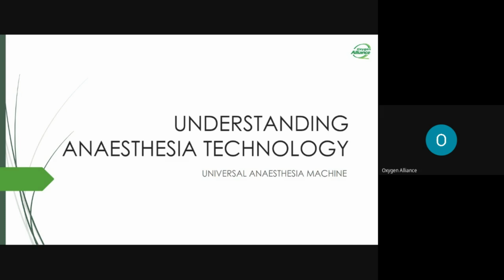So we also have a comment in the chat from Rock Musoli, which says, during calibration, you have to check for leakages in the pipeline and the bellows housing. So I guess this is also something that you would need to pay attention to when you are doing your calibration. I see we have a hand from Chimwemwe. Is it responding to the same? We also have one outstanding question from Robert about the oxygen analyzers. So Chimwemwe, if it's relating to the same, then you can respond to that.